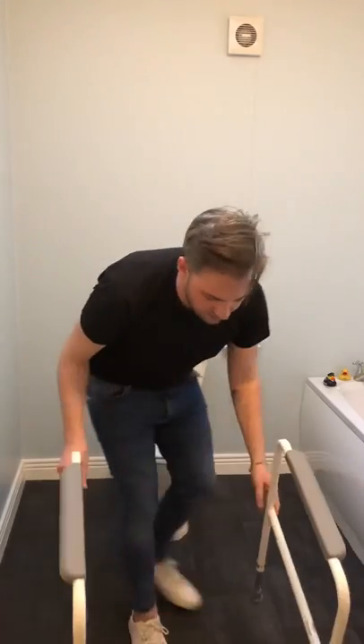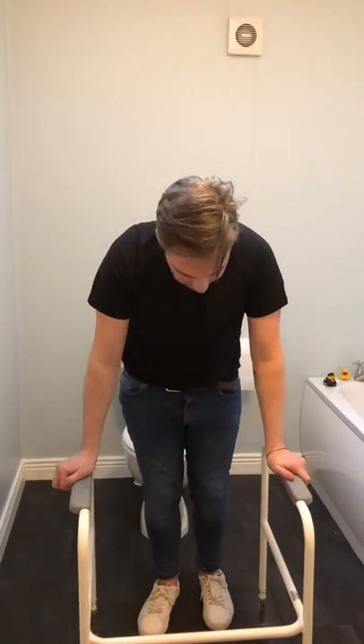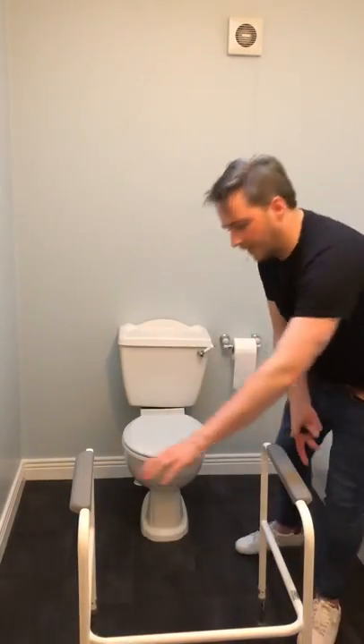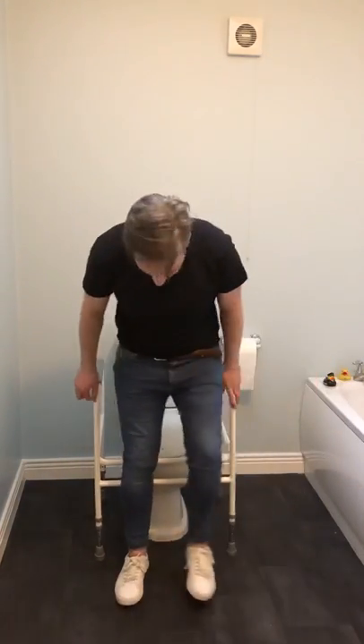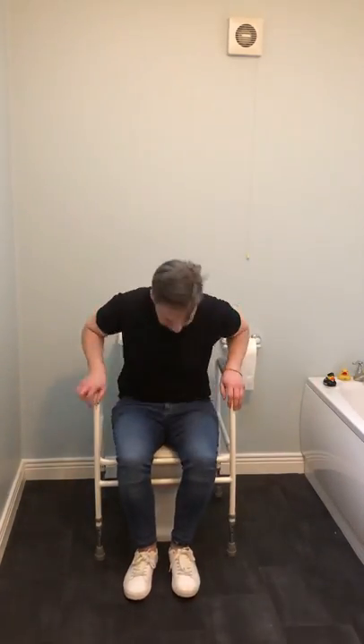Then just give it a little check. It looks stable — put it back in place and then just give it a try yourself. You're trying to sit and stand, just using it as leverage to push yourself up. Okay, thank you.